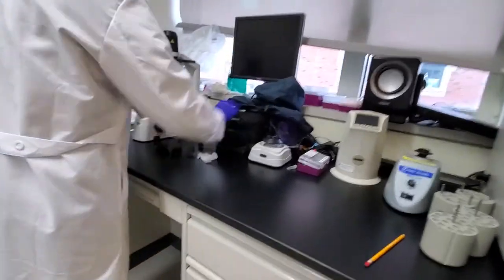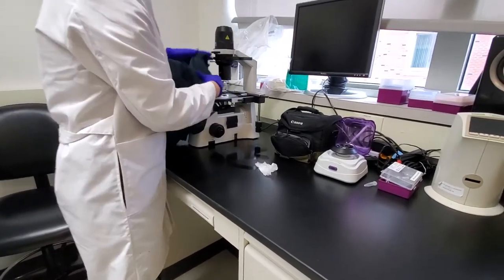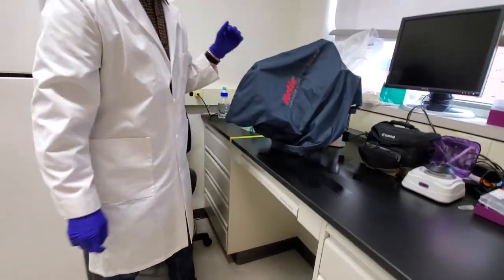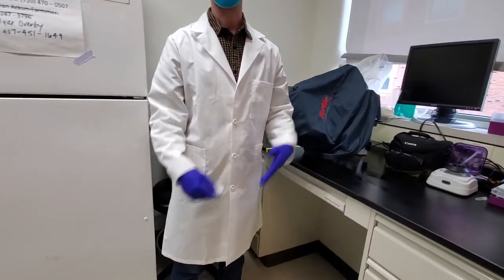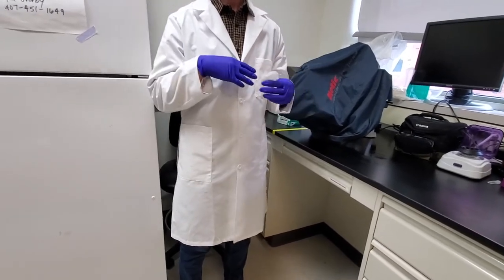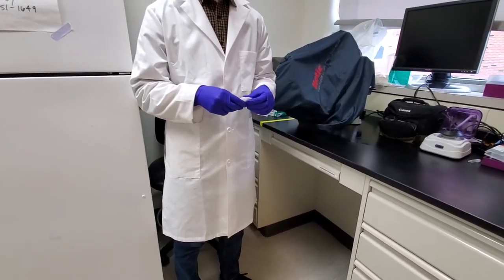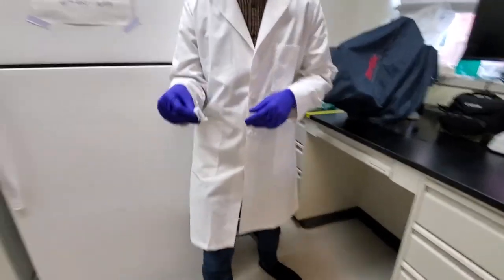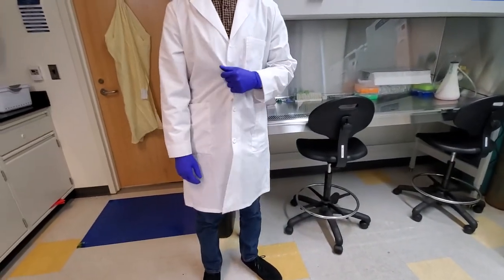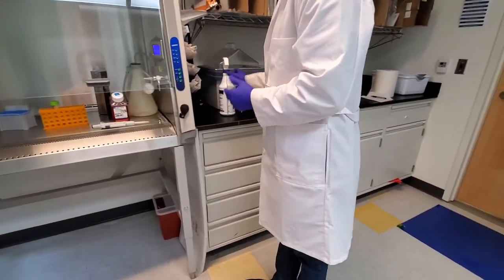So in terms of caring for these cells, I change the media every 2 to 3 days and check the cells. They grow very fast, so either use them, or passage and reseed them before they get confluent. So you have experience telling confluency and passaging? Would you say 80% confluency is a good time to passage again? Yeah, 70-80%. These ones can be a little hard to tell, and they grow so fast. You think they're 50% confluent, and you come back the next day and they're 100%. So they're not too sensitive if you do them a little early or not.